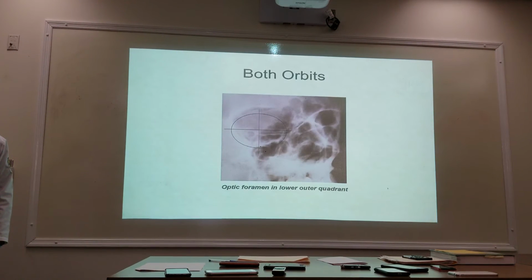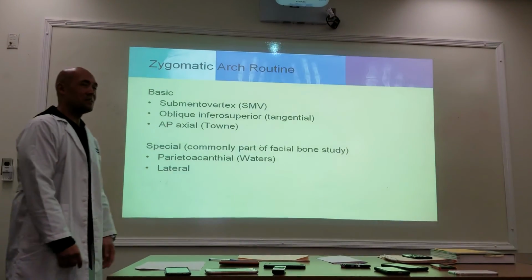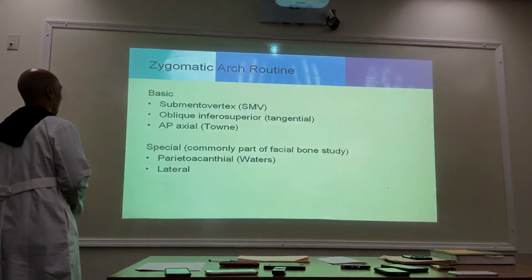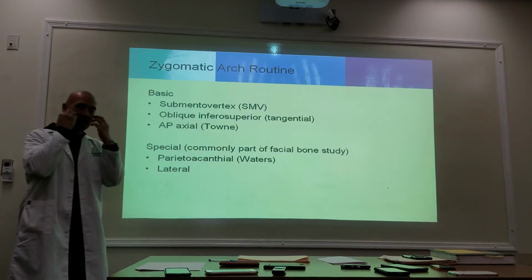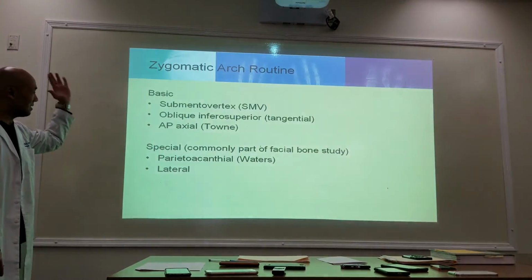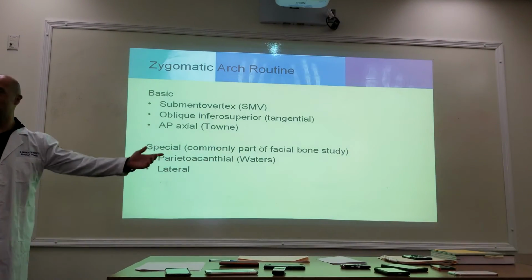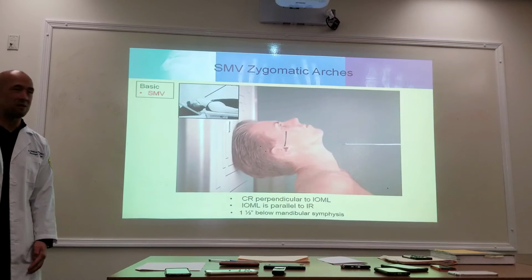There you go. Bingo. All right. Zygomatic arches, what's that? Cheekbones. You guys recognize the views already? They're the same views over and over again. You guys already know the SMV, so here's your SMV.